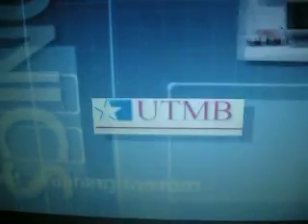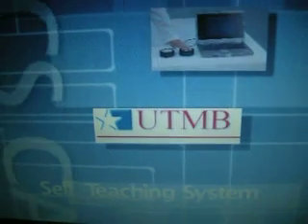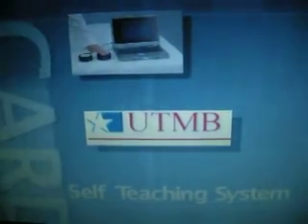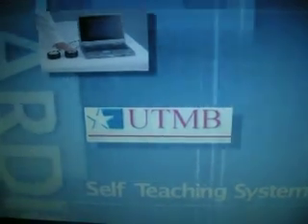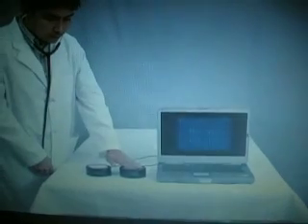Through an agreement with the University of Texas Medical Branch in Galveston, Cardionics can now supply the UTMB student self-teaching system, which consists of 4 computer lessons, an auscultation evaluating program, and a sound reproducer for the student's stethoscope and a pulse reproducer.